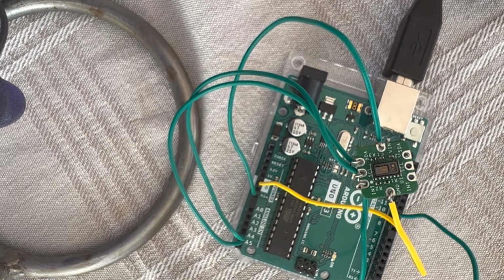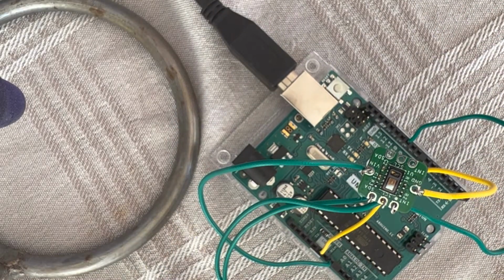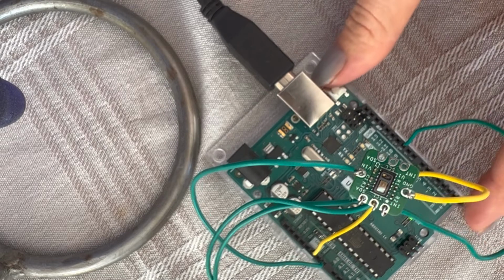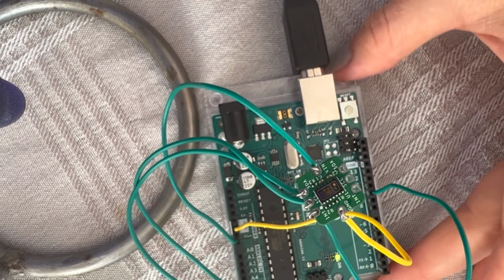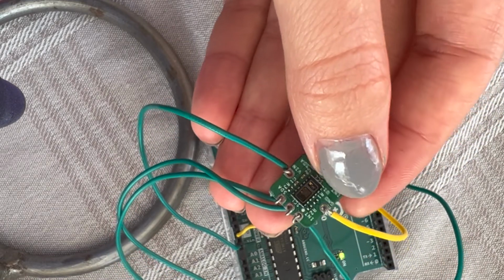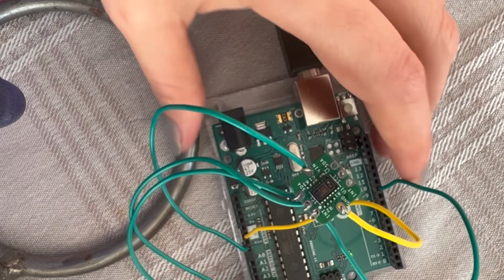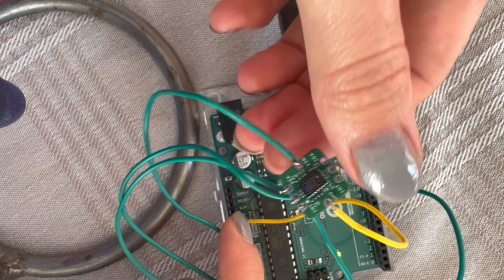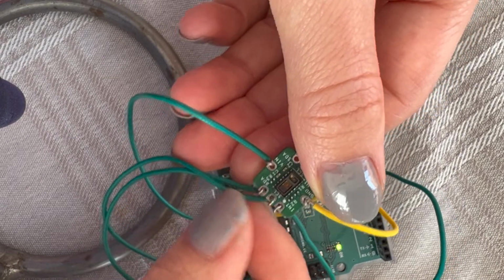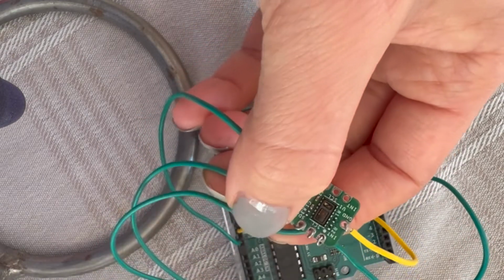As you can see, we have connected this, and then I just use a USB and connect it to the computer. This is on, but okay, we don't see the LED turn on. Let's see what's going wrong here. This one is connected. Number 10. Oh, I think these two are the wrong way, because SCL, I told you it should be to A5.